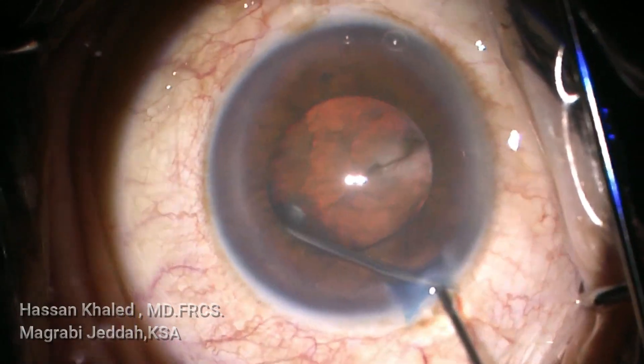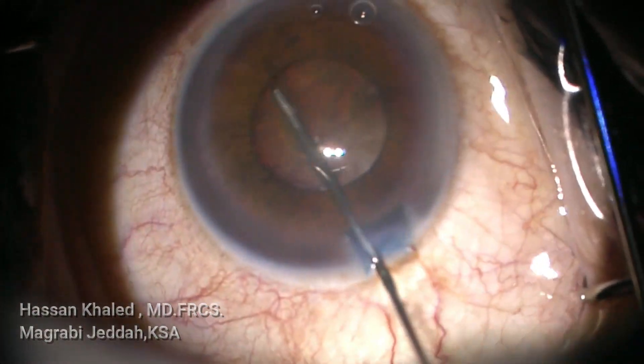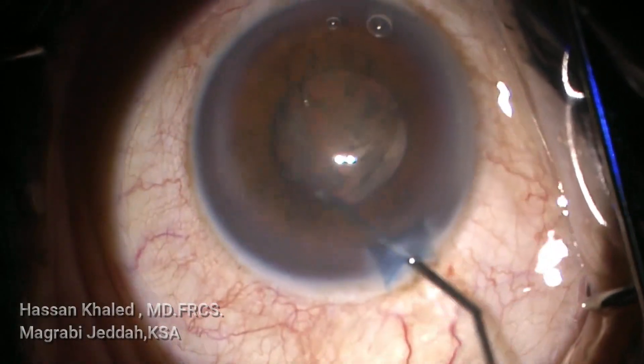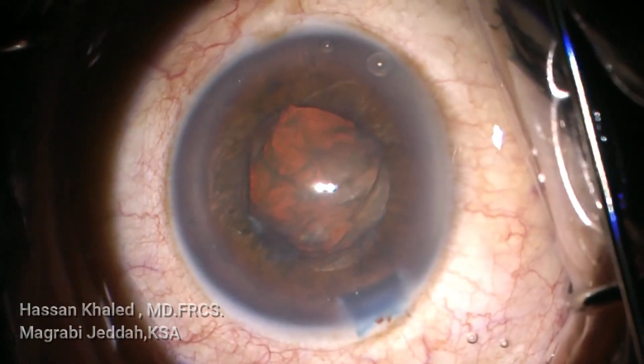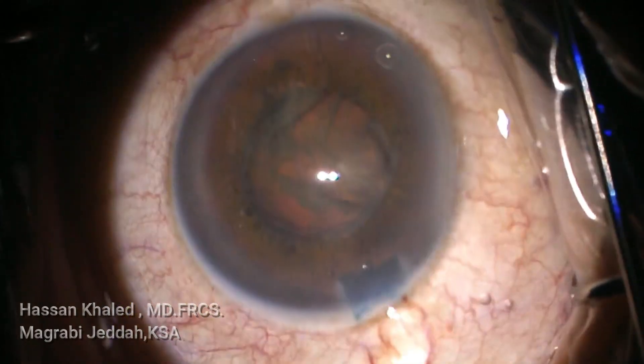Now doing the hydrodissection — you can see the wave. After that, you can see the pupil start to constrict, now about 2.5 to 3 millimeters. You can see the nucleus is rotated, which means the hydrodissection is successful. You can see the rotation of the nucleus.